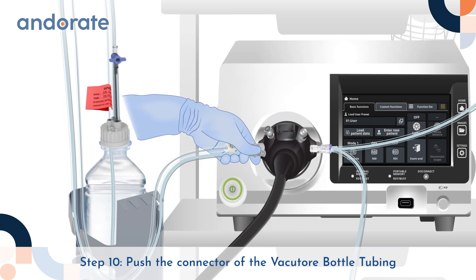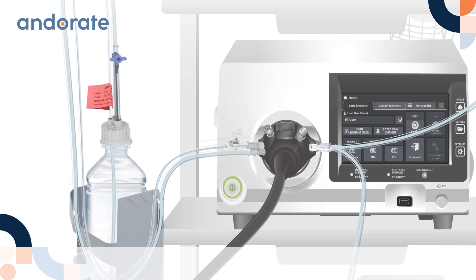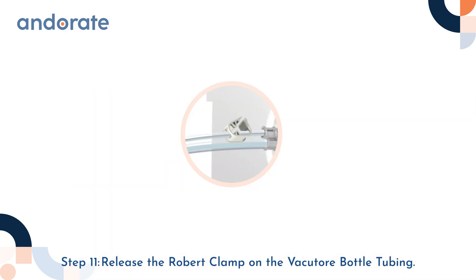Step 10: Push the connector of the Vacuator bottle tubing to the air-water connecting port on the endoscope. Make sure the connection is tight. Step 11: Release the Robert clamp on the Vacuator bottle tubing.